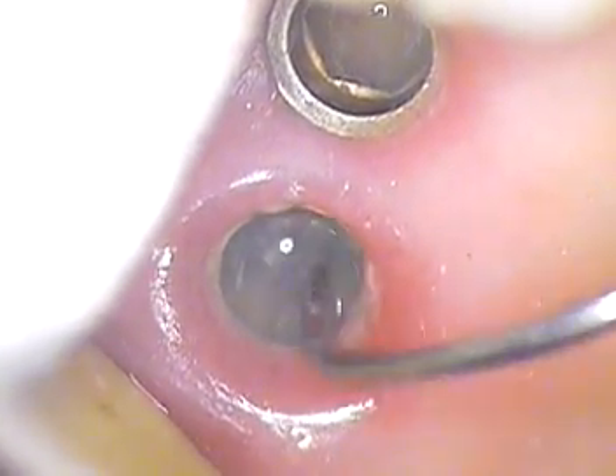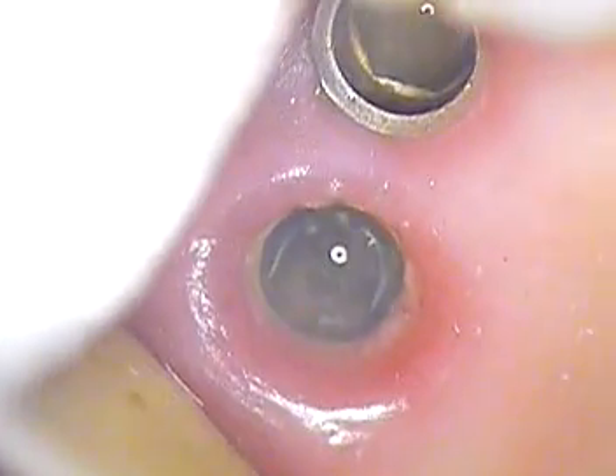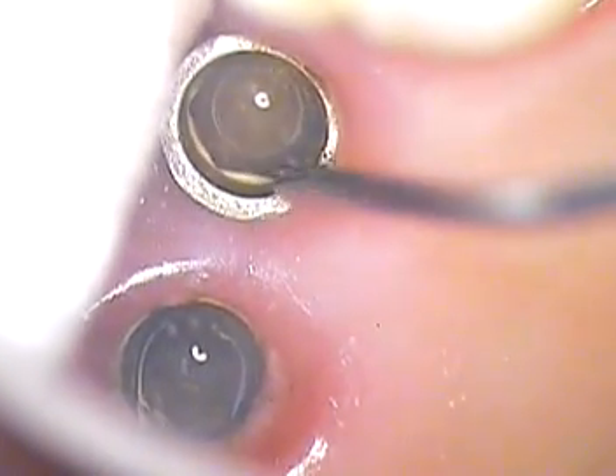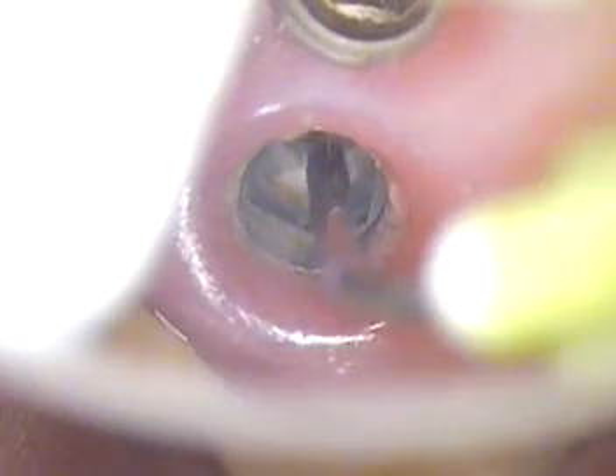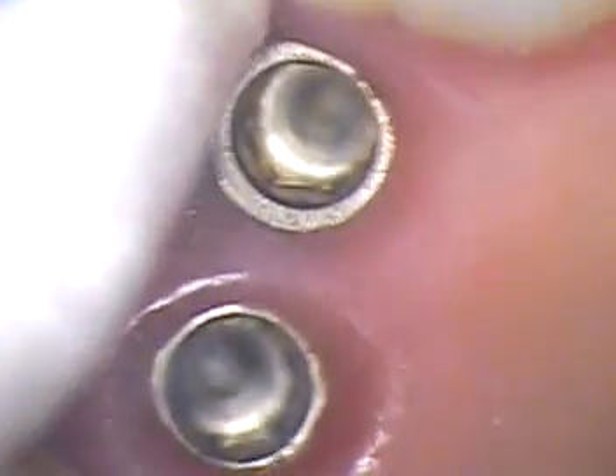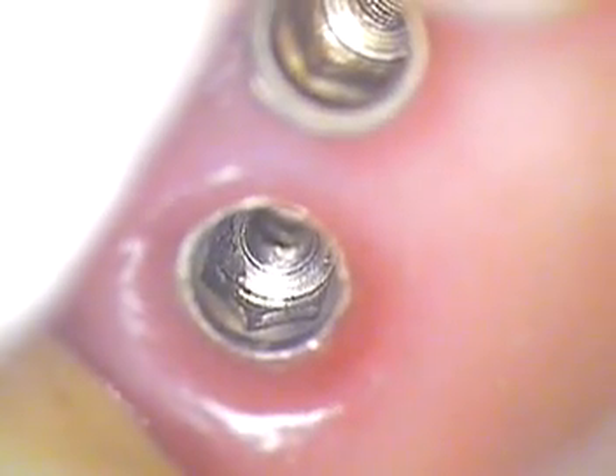We'll do a micro suction — suction that out. Taste anything weird? Anything bad? No? Okay. So that's suctioning out with a micro suction tip, we're just vacuuming all that out. Then we're going to go right back in again with a fresh batch. Cleaning up nicely — not only bio burden, but we've got food particles, things that have been in there a long time. It's starting to clean up nice. I can see a shininess to the surfaces. Looks good.